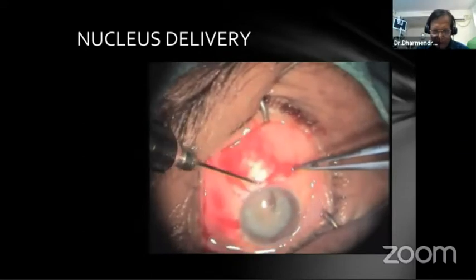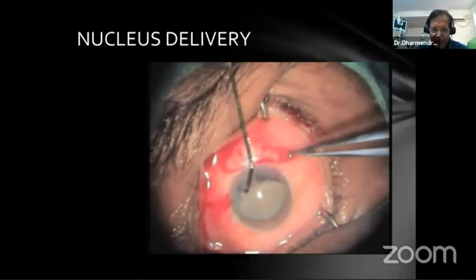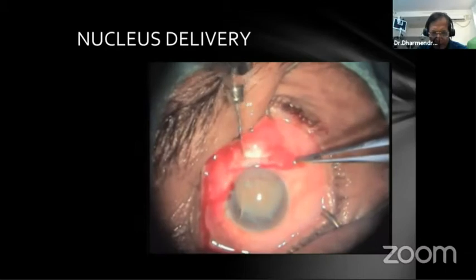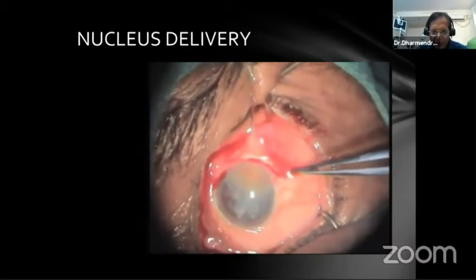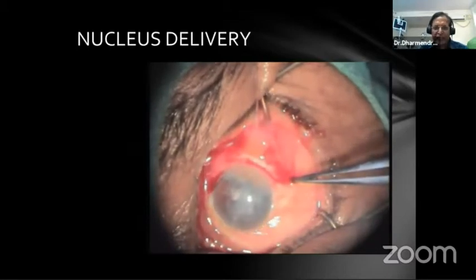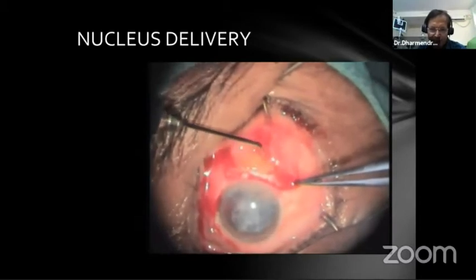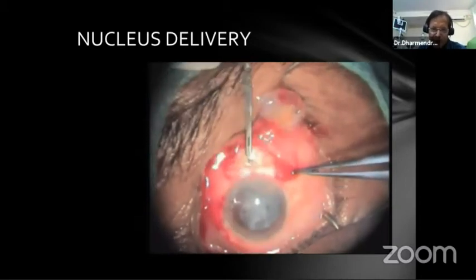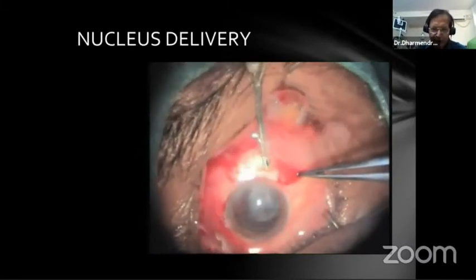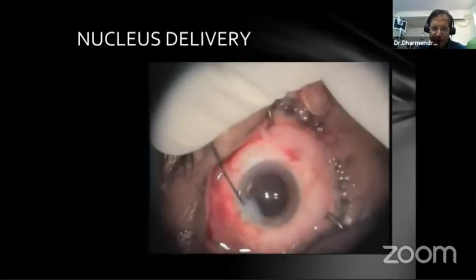Go to the equator with the cannula, lift it up, and just see now, this is a different technique. Keep on seeing the tip of the cannula, engage the nucleus in the curve, and pull it out by depressing the posterior lip, slowly, gently. So this endothelium is very friendly to the cortical matter. This is the epinucleus, and this is how it comes up. Just by irrigating, take out all the lens and cortical matter, wash it out, and implant the lens of your choice.